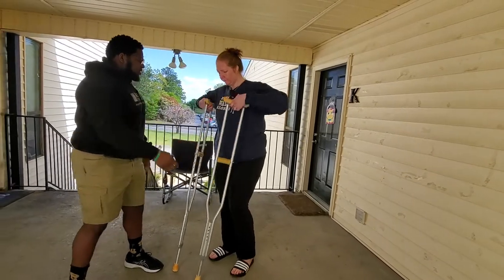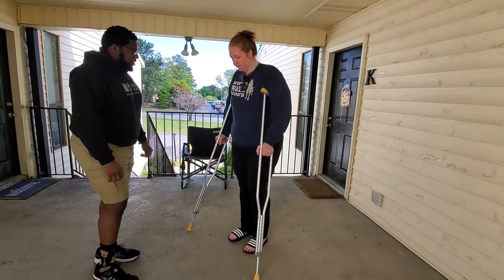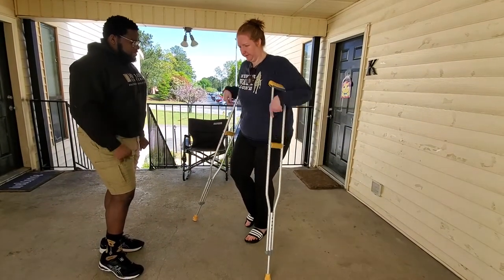I'm going to give them to you — make sure they're fitting. Four to six inches out, to the front, and about two inches away from your armpit. Looks good.